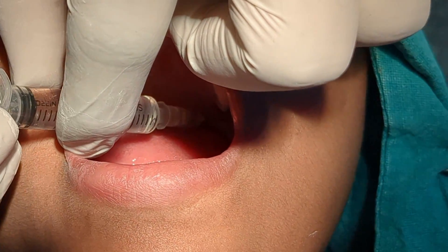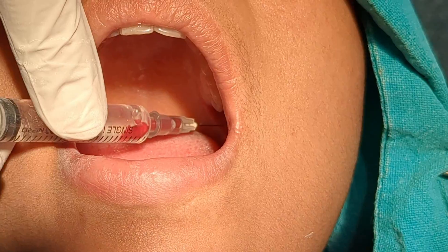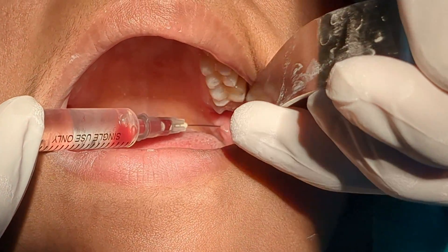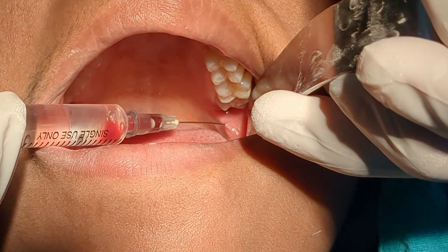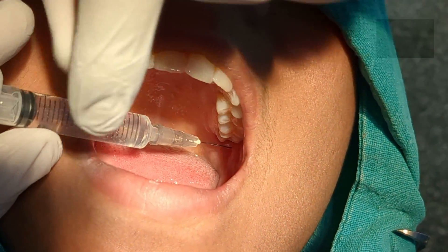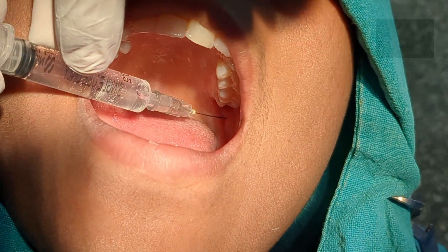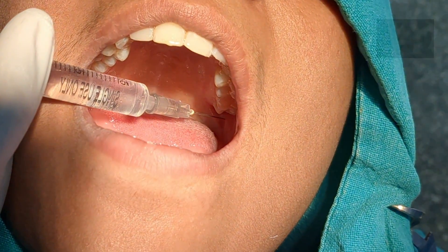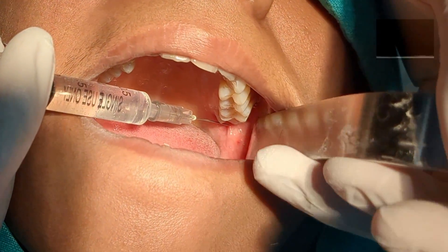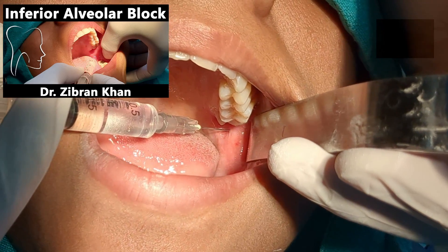When I aspirate the syringe before inferior alveolar nerve block, the aspiration comes out as positive. So I withdraw the needle out of the tissue and administer the inferior alveolar nerve block with a new syringe. I aspirate in two planes and deposit local anesthesia for the inferior alveolar nerve block. For a detailed video on inferior alveolar nerve block, watch the video on the channel.